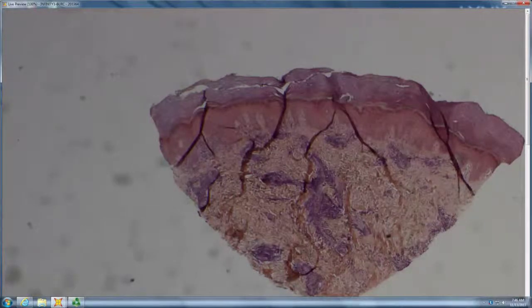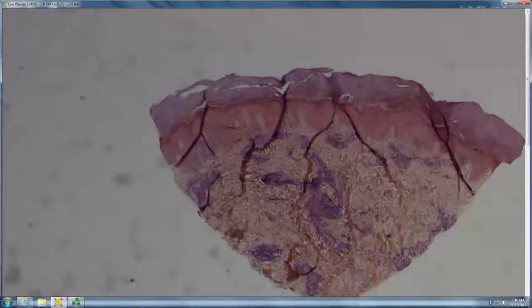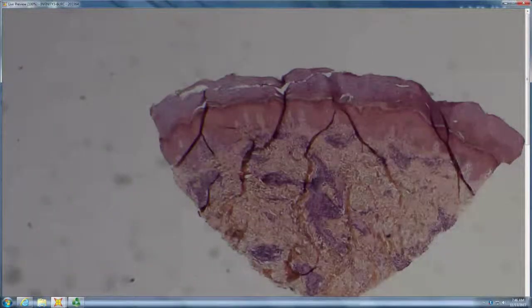So what's your differential for lymphocytic capillaritis? The pigmenting purpura. Yeah, that's basically the category you're in, pigmenting purpuric eruption. The one thing you have to remember is MF can look like that too, so make sure you're looking for subtle epidermotropism, because MF can really look like a pigmenting purpuric eruption. So you look carefully at your epidermis, no lymphs, no basilar tagging, so it's okay. So this is just PPC. And then to confirm the diagnosis, you're going to get an iron stain and see that it's chronic enough that you've had some hemosiderin there too. That's absolutely correct.